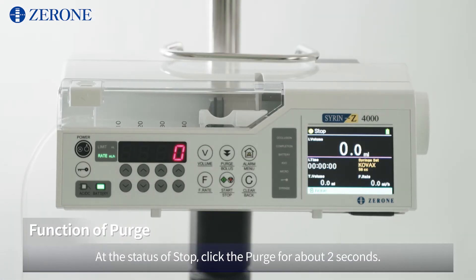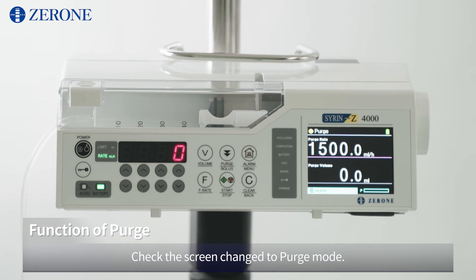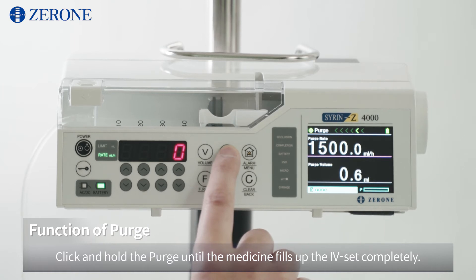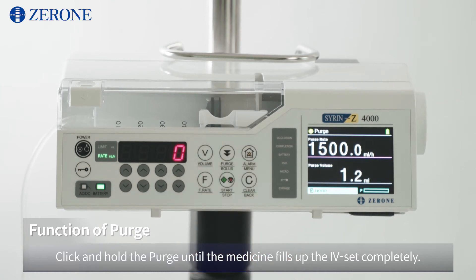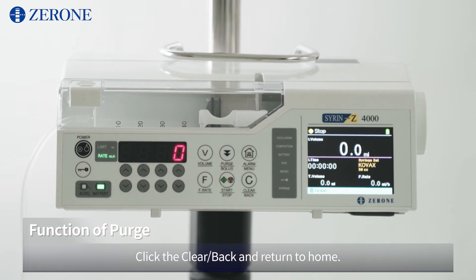At the status of stop, click the purge for about 2 seconds. Check the screen changed to purge mode. Click and hold the purge until the medicine fills up the IV set completely. Click Clear Back to return to home.